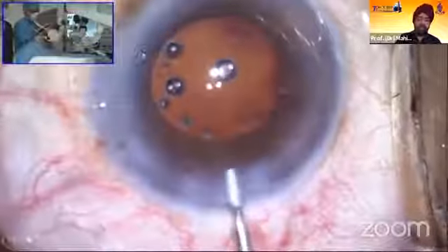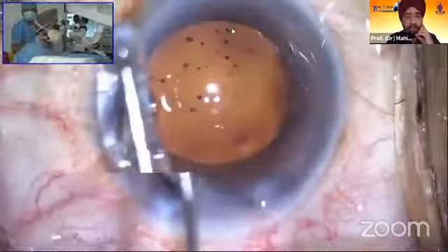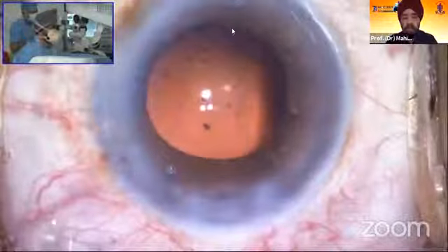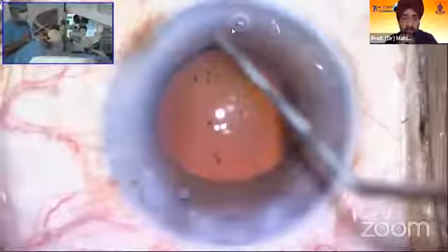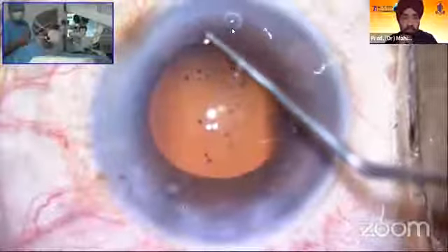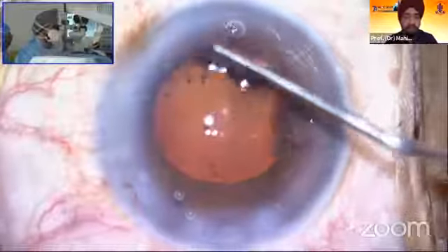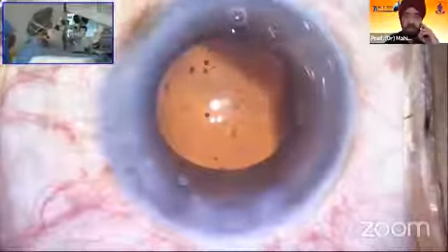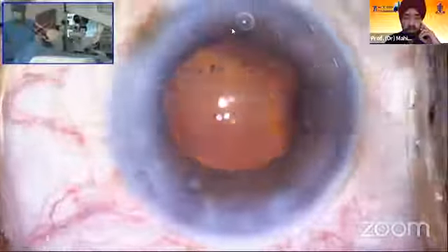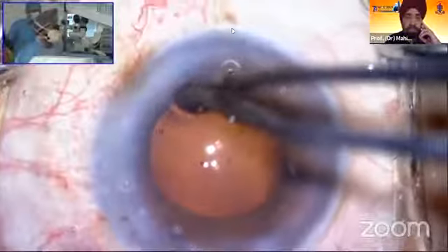Now we'll be going in for the CRV lens — the continuous range of vision lens — which is the Synergy. It is a combination of a trifocal and an EDOF lens. This is the LRI that had been made because the patient had a small amount of astigmatism, and we are opening the LRI. I normally do a full-thickness LRI rather than just an intrastromal. With an intrastromal you have less irritation for the patient but the effect is slightly less. So full penetrating LRI is what I normally do.